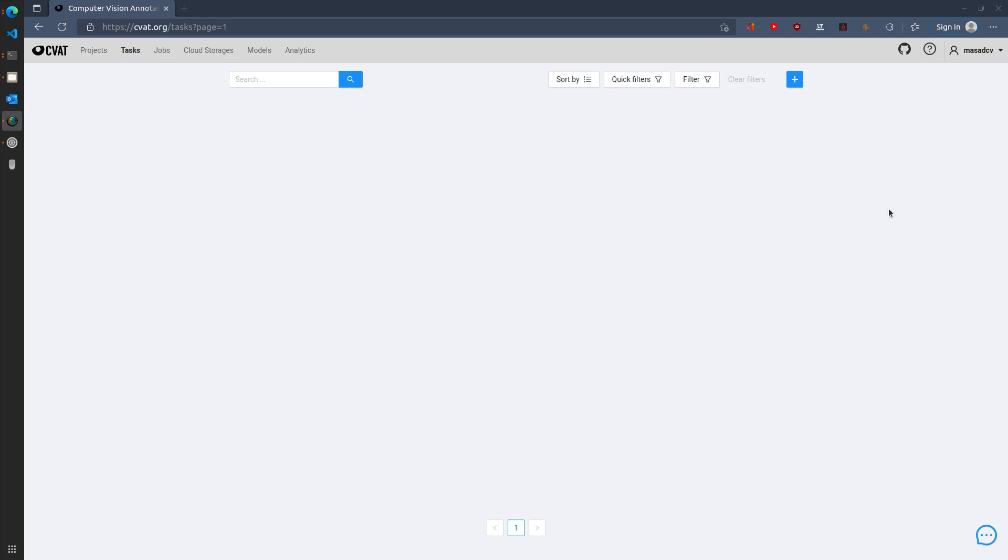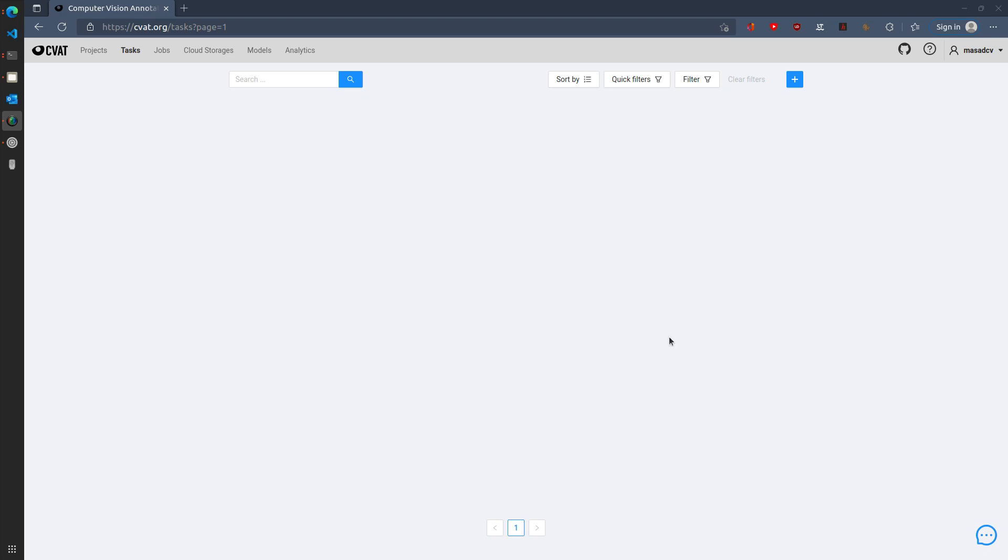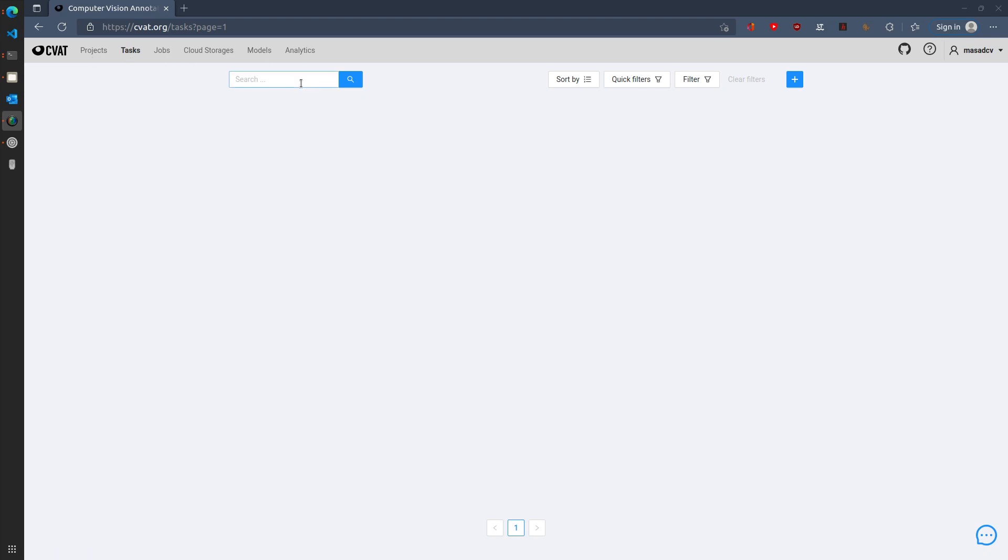To begin with, I have already logged in to the cvat.org server. This can also be similarly an internal server from your organization. When you log in, you are presented with the tasks tab where you can see your tasks. At the moment I have no tasks, and on the top right you see different tabs which include projects, tasks, jobs, etc. Then you see an option to search through your different tasks. You can also sort them or filter them, as well as add new tasks.